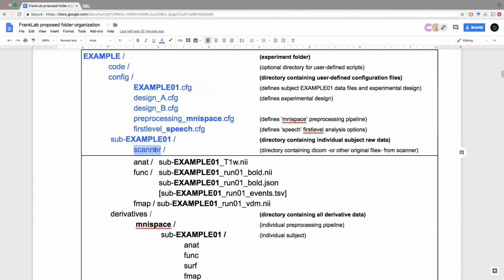So I think we could. I'm fine with it being a pointer. If it's just one file for this purpose, we could copy the file too. We're kind of doing that for when we do the derivatives in the pre-processing steps. We're copying over the input file that we're using for these, and then doing the pre-processing. So I'm happy either way there, but we do need to have something in here. So for example, whatever that study is, study example, there would be another folder in here that would be the FreeSurfer directories. Right.